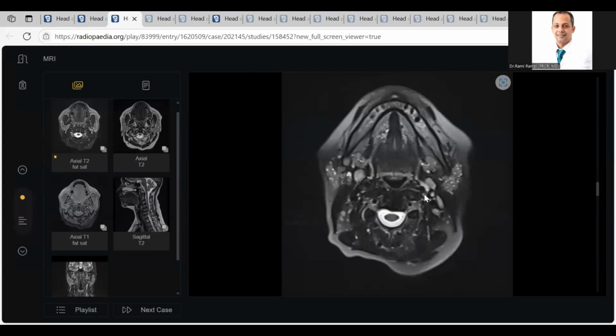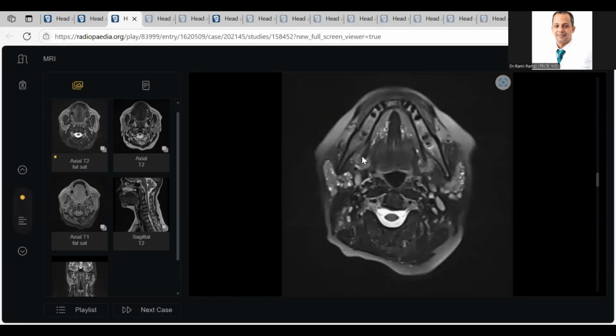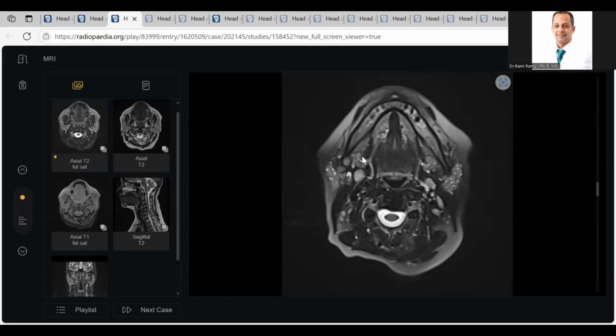Why? Because the differential diagnosis is either Sjogren or parotid cysts or lymphoepithelial lesions. What is the critical differentiating point? My colleagues, if you tell the examiner from the beginning, "Doctor, there are bilateral abnormalities in the parotid, I will check the submandibular," he will understand that you are differentiating between Sjogren and AIDS-related lesions.